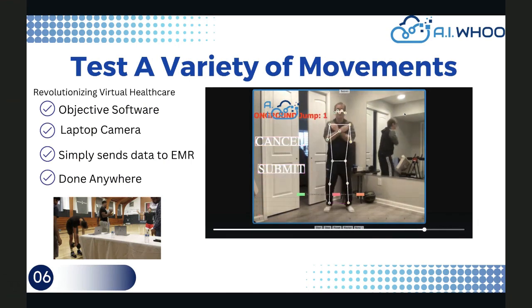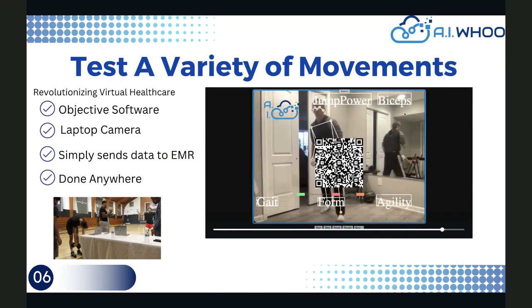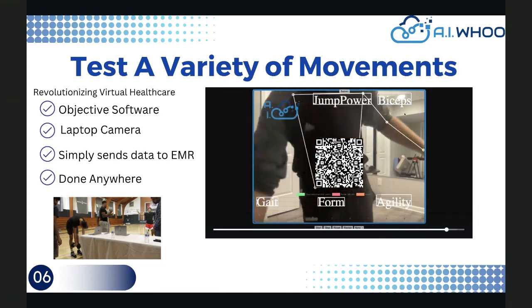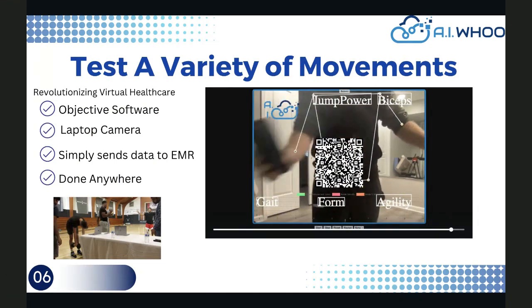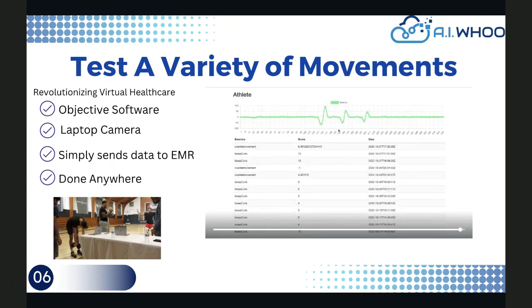So if you have an athlete and they get injured, at what level are they back to play, if you will? So I did my 3 jumps, and now you can scan the little system, and you can see the peak. You can see the power that I'm generating, or more specifically, the speed that I'm doing on the liftoff. So we get my little graph right there. You can see that my first jump was the highest, and because I'm in the basement, I was like, oh, I don't want to hit my head, so I jumped a little bit less. So it finally gives me a score of 6.46, which is essentially 6.46 miles per hour. That's how fast I was jumping.